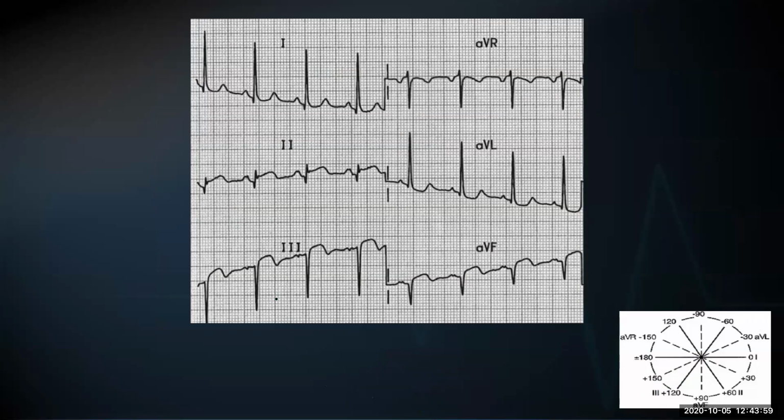All right. Lead 1, see that's positive. I think this one I did the arrows correctly. And then lead AVF is negative. So what do you guys think this is?